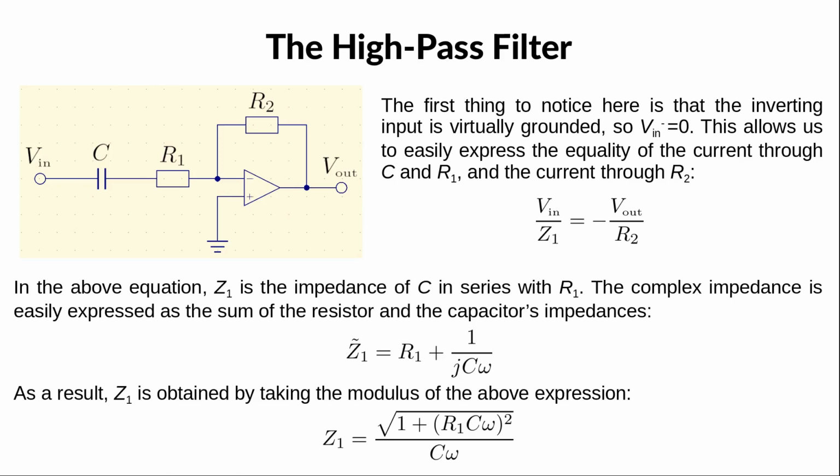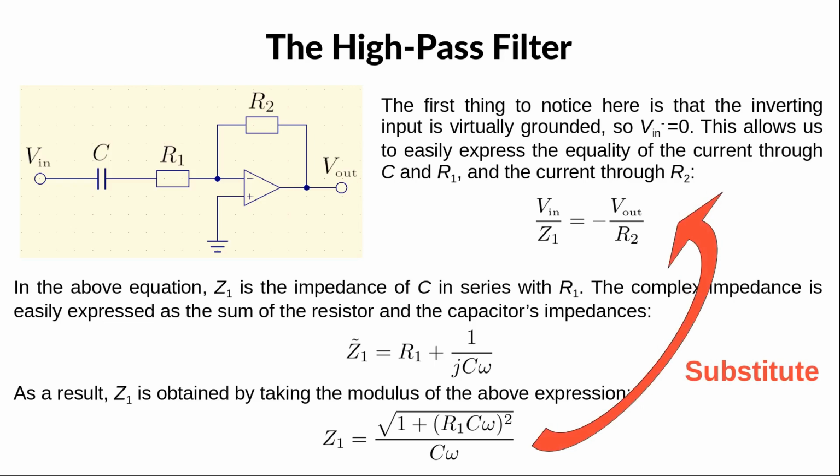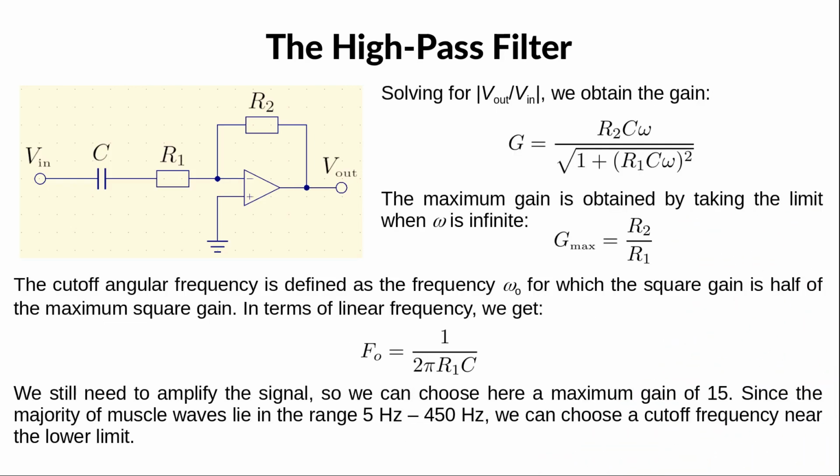The output of the filter can easily be determined by expressing the equality between the current through the capacitor C and the resistor R1 and the current through the resistor R2. If we call Z1 the impedance of C in series with R1, then Vin over Z1 is equal to minus V out over R2. The complex impedance Z1 tilde is just the sum of the resistor and the capacitor's impedances. The real impedance Z1 is then obtained by taking the modulus of the complex impedance. Now all we have to do is to substitute this impedance in the first equation, from which we deduce the expression of the filter's gain.